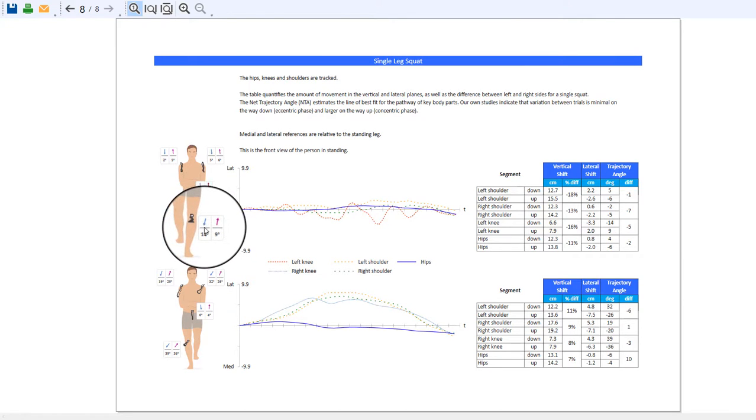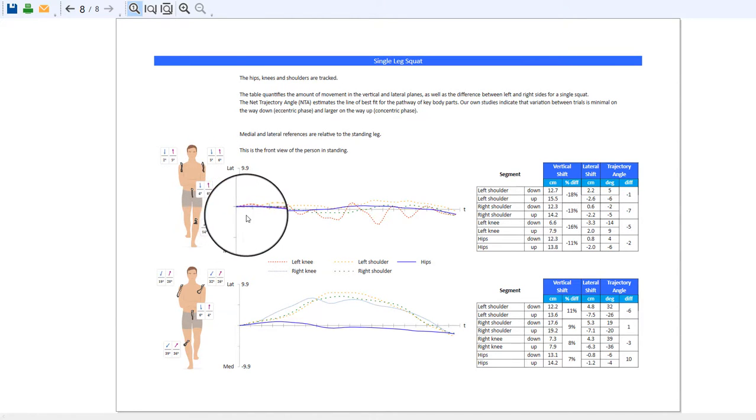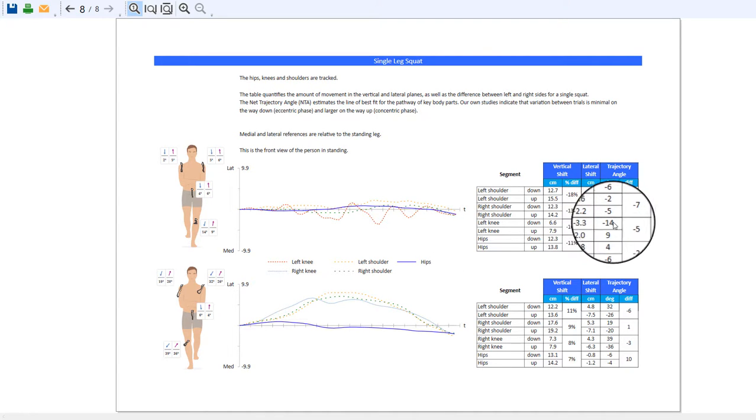The biomechanics report shows a net trajectory angle of 14 degrees — a non-linear representation of the net result of all of this shaking, with a tendency to go inwards. The upper body looks very nice with small trajectories. Looking specifically at the path of the left knee, it shakes over the midline: going laterally first, then back, then back to midline with a tendency to go medial — hence a net trajectory angle of 14 degrees — and the end position of the knee at the bottom of the squat being medially by 3 centimeters.